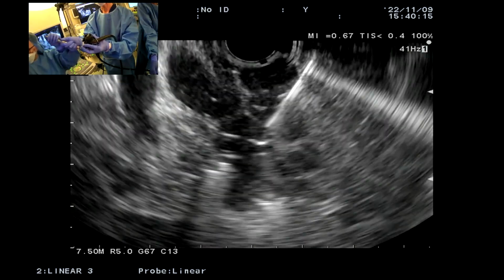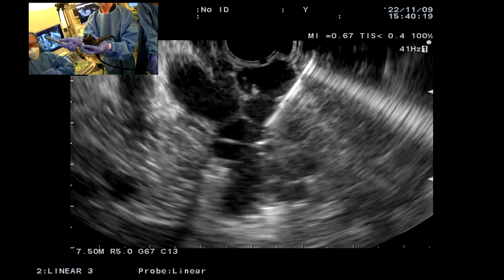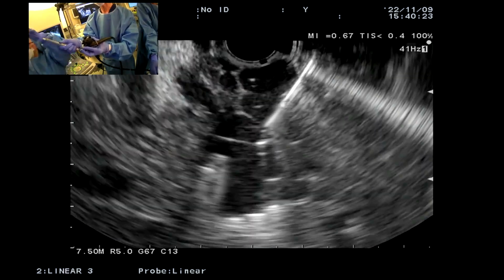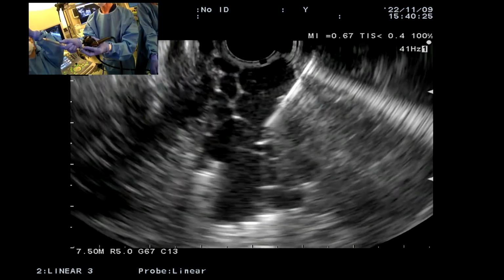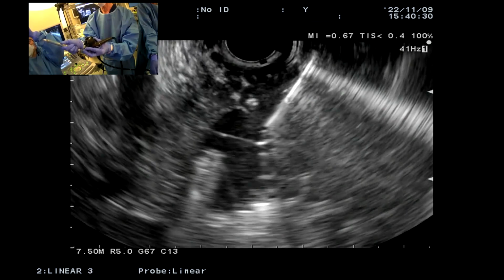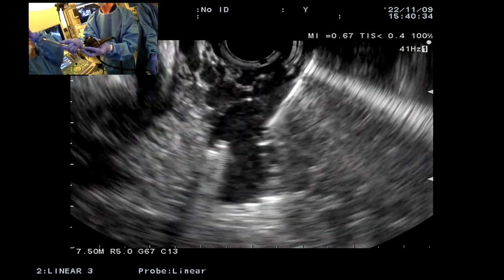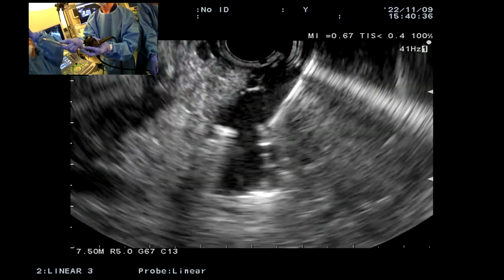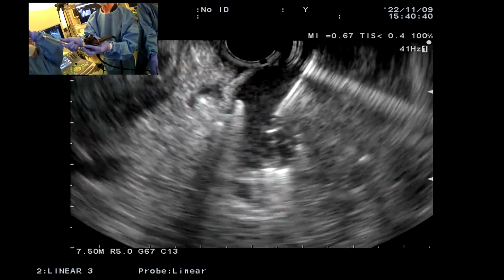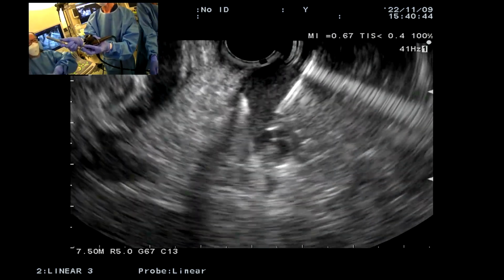Okay, good. And the other thing to remember is there's very rapid blood flow in these varices. So what the coil is doing is it's slowing down the blood flow a little. So that also helps prevent embolization. There's just more time for the glue to seat itself inside the varix, whereas when you have rapid blood flow, it'll very quickly flush out.